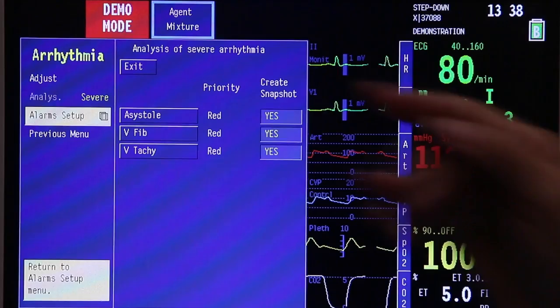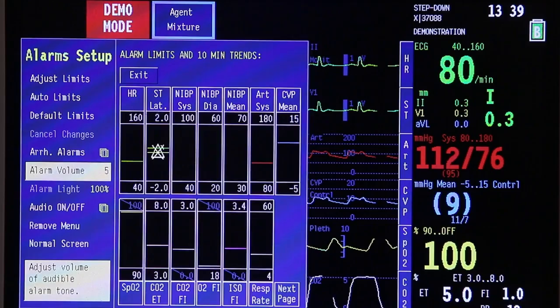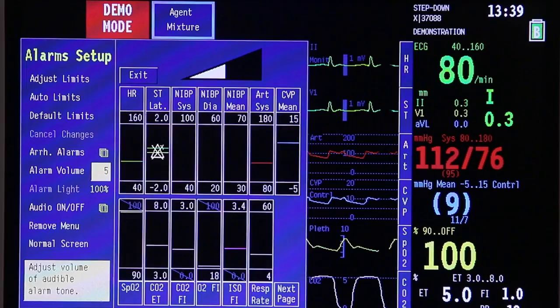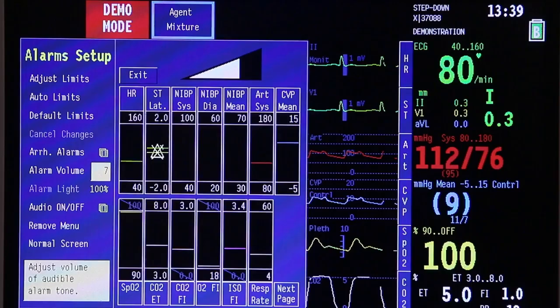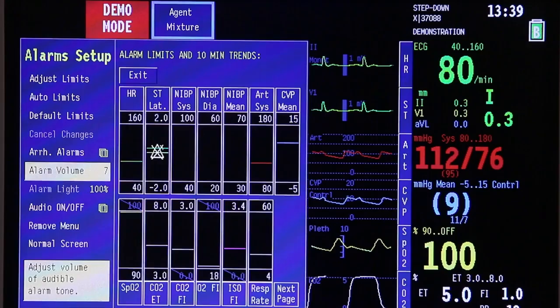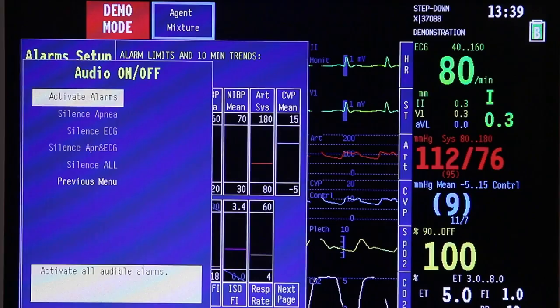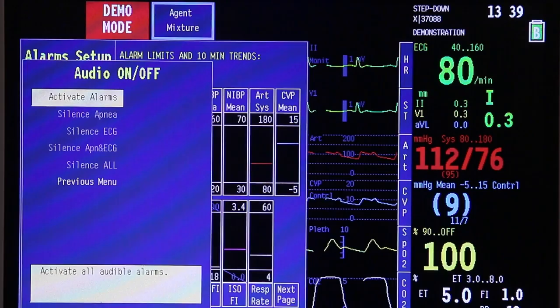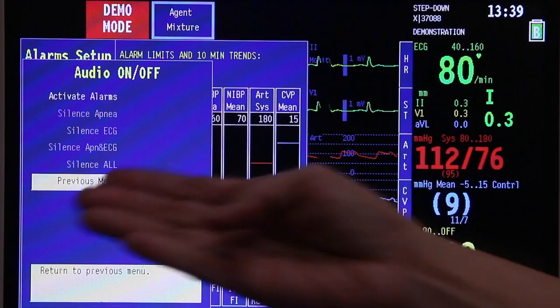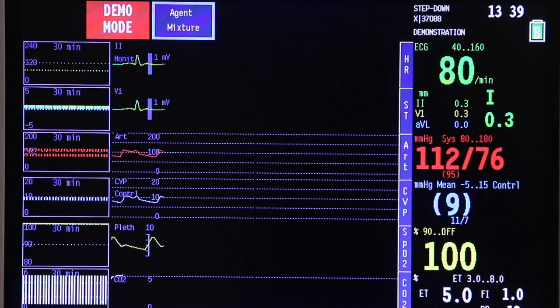Next, go to alarm setup and press once — you are back to the alarm setup page. Scroll down; after alarm limits, the highlighted portion is now the alarm volume. Press once to adjust the alarm volume. If you want a higher alarm volume, press and you will see the numbers changing. Press the trim knob once again to set — alarm volume is now at level 7. If you want audio on or off, press that button. The options allow you to activate alarms. Once done, scroll down to go back to the previous menu, then press normal screen to return to your home page.